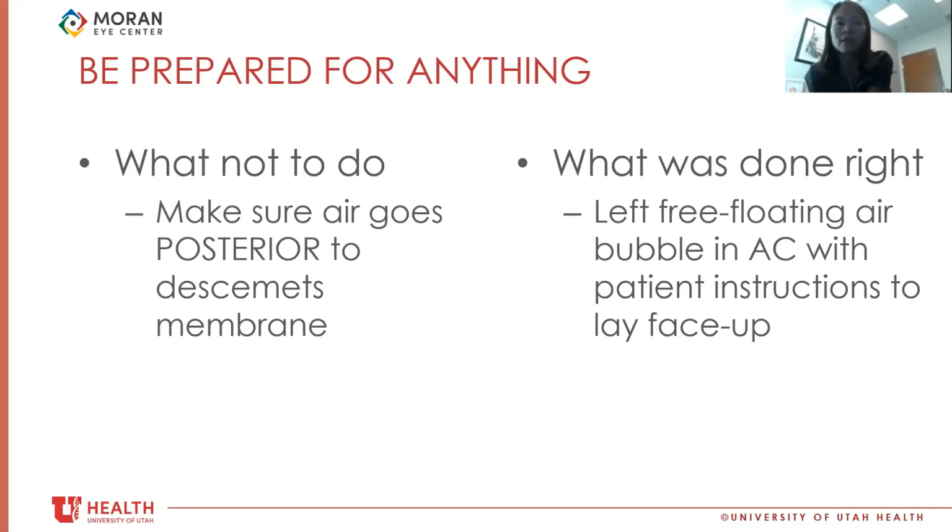Yeah. Okay, cool. How would you have managed this differently? Sometimes we get patients with detached Descemet's during cataract surgery while injecting viscoelastic. Yes.